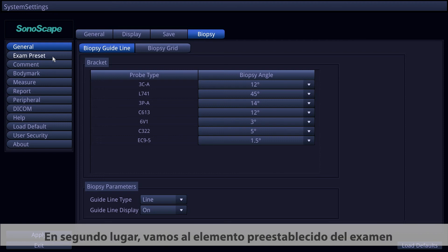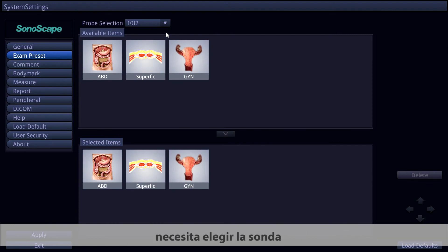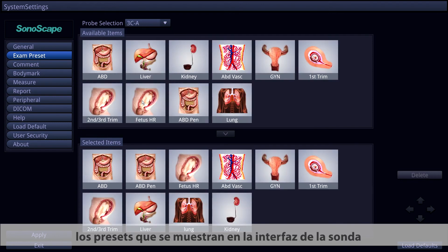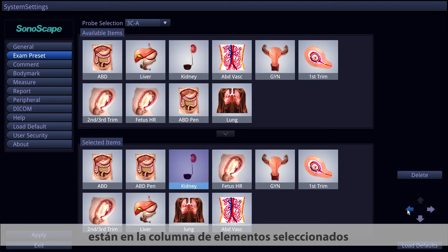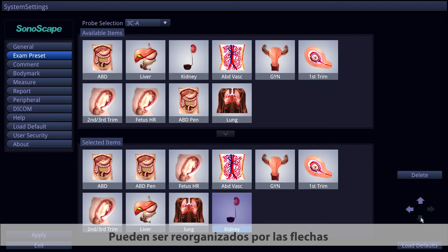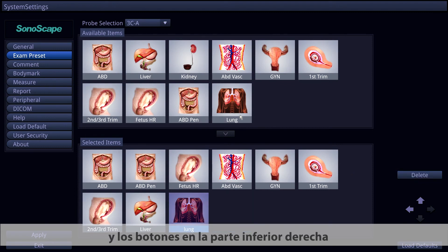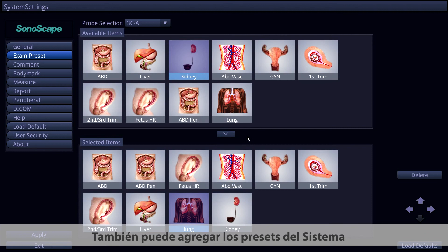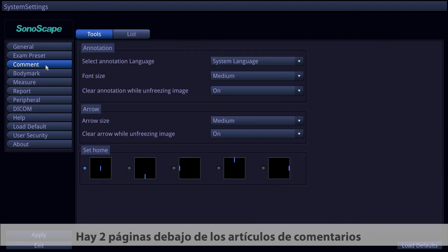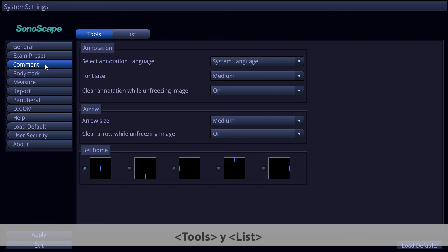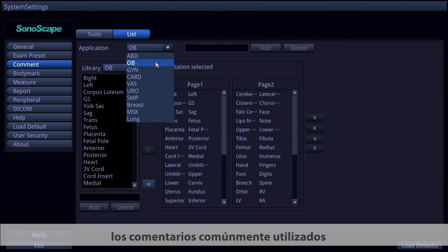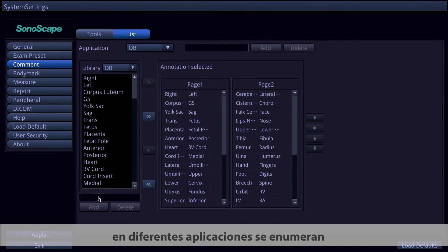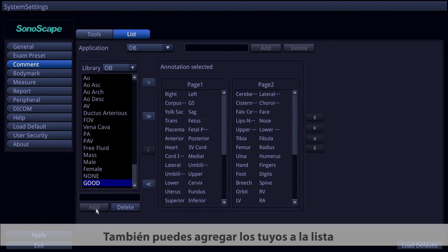In the Exam Preset item, choose the probe you want to change the preset for — the presets shown on the probe interface appear in the selected item column. They can be rearranged using the arrows and buttons on the bottom right, and you can add exam presets to the selected items. Under the Common Items, there are two pages — Tools and Lists — where you can customize annotation elements and manage commonly used annotations for different applications.